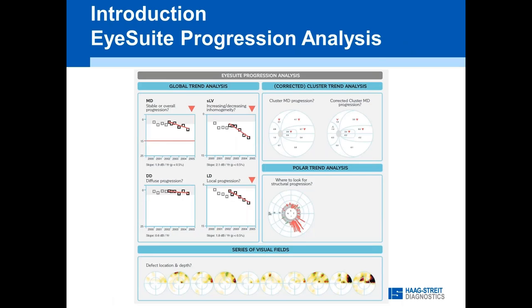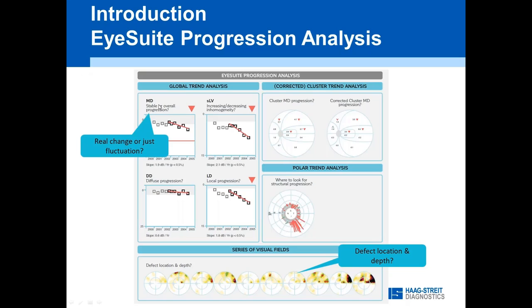Here's an overview of what the iSuite software offers for progression analysis. First, we still show the series because that gives us information about where the defect is and how deep it is — very important for how aggressive your treatment needs to be. Then on the top left, we look at mean defect change to ask: is there real change or just fluctuation? This also answers the speed of change. Then we look at whether the change is diffuse or local, and we have cluster and polar trend analysis.